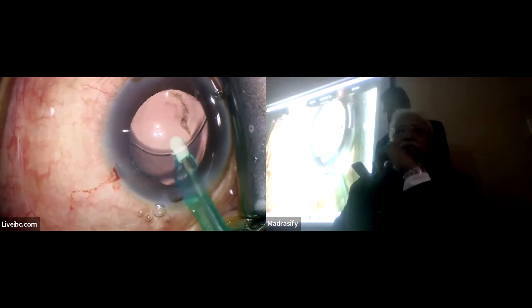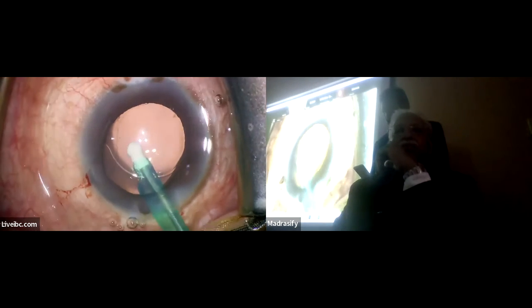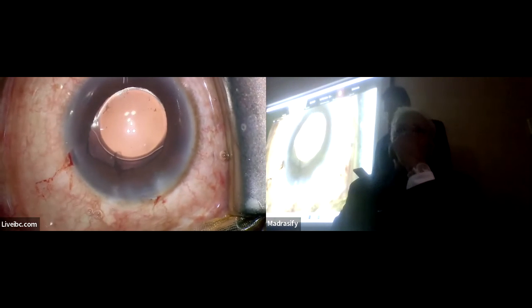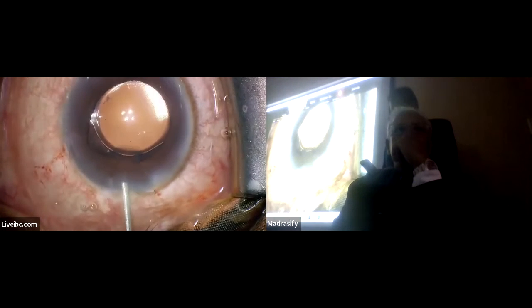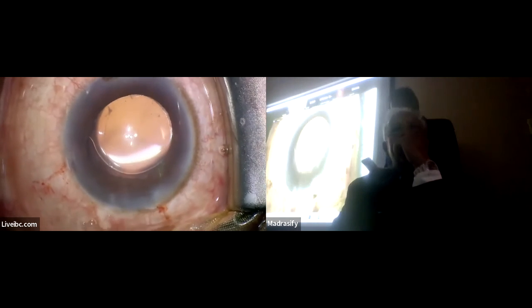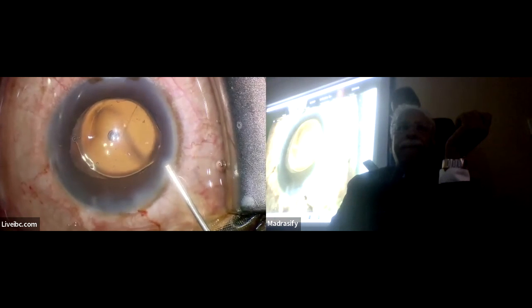It's going to go behind the lens now to remove that sticky material behind it. That's all. If there is any cortex, yes — so that's the end of surgery again. Thank you.